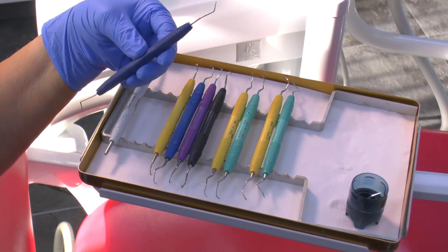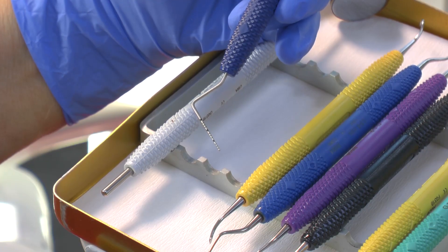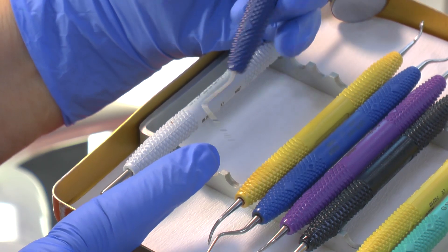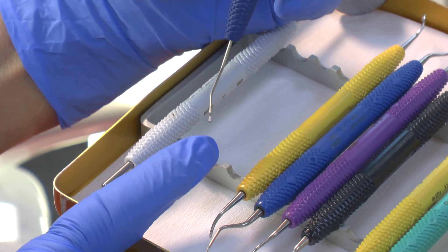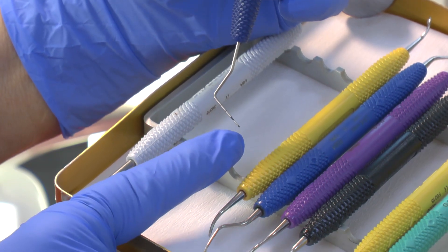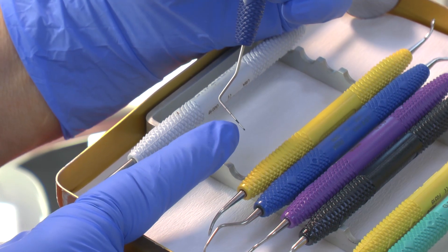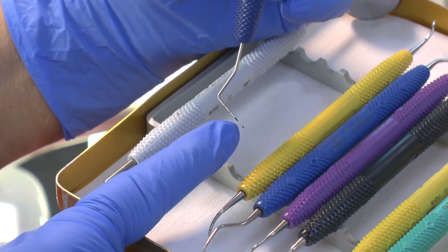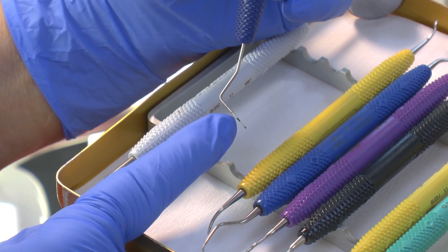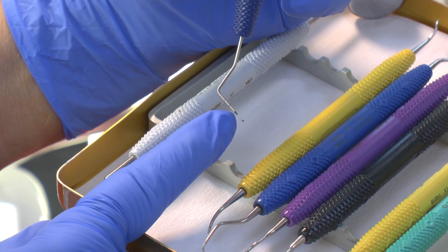This is a double-ended probe that I like. It's a UNC pocket probe here with a BPE probe at the other end. The BPE probe has the little ball at the end, the silver part and the black band that tells you whether you're in a code 3 or a code 4. If the black band disappears you're code 4. If the black band is partly showing, you're code 3.